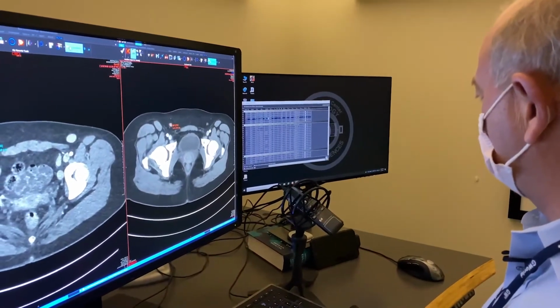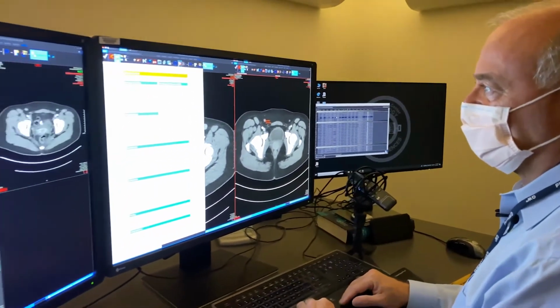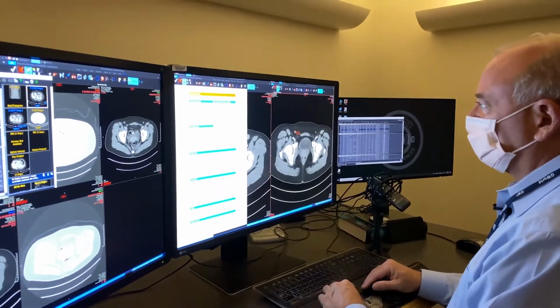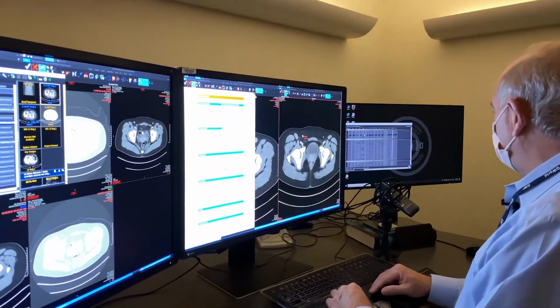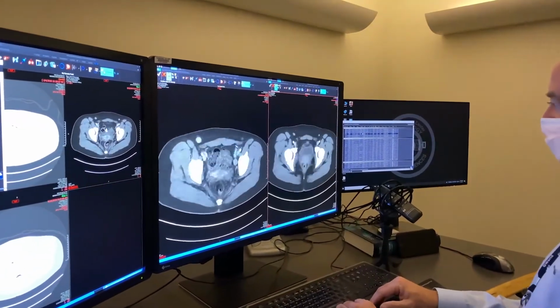So now we can go to the table, and then we can look and follow these lesions and graph them over time, which I've only got one really as a target and specified and matched the same way. But that's where that comes in handy.